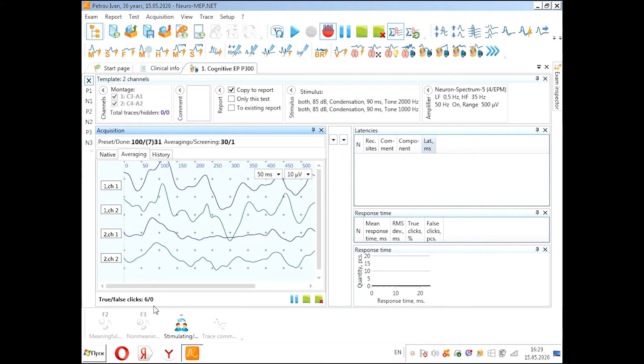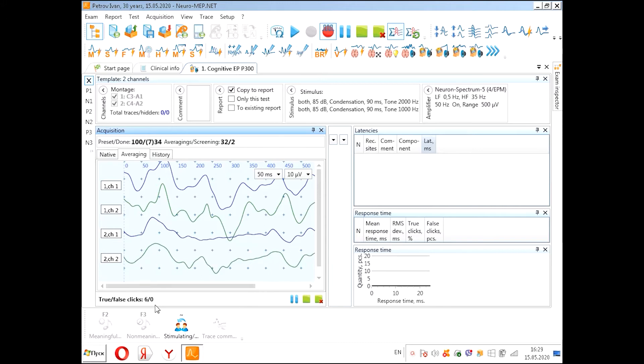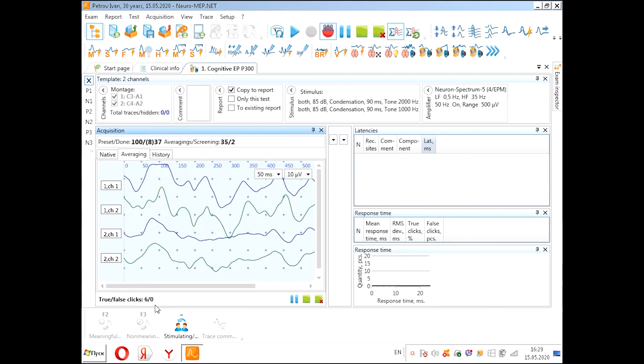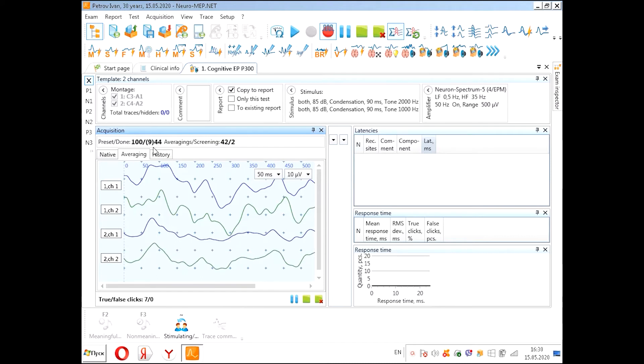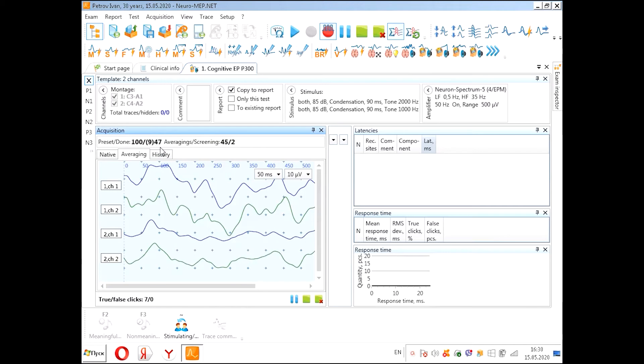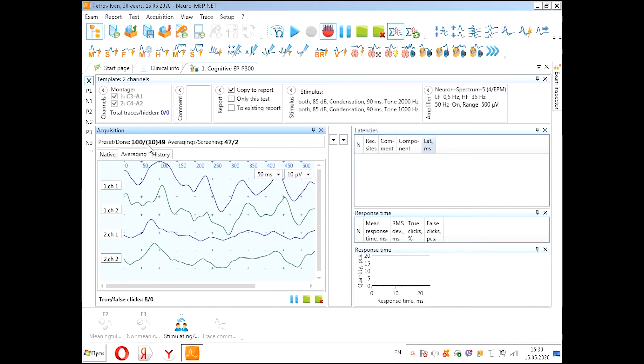Here we see the true and false clicks on the patient button. This information comes from the patient button. Here you see that the device has delivered 38 stimuli now out of 100.